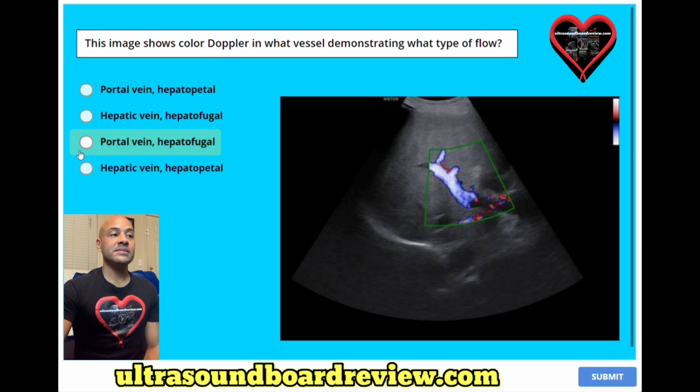The answer is C, portal vein and hepatofugal.